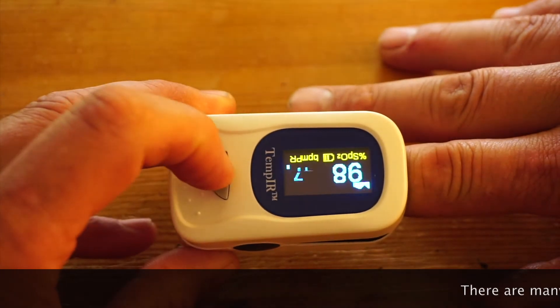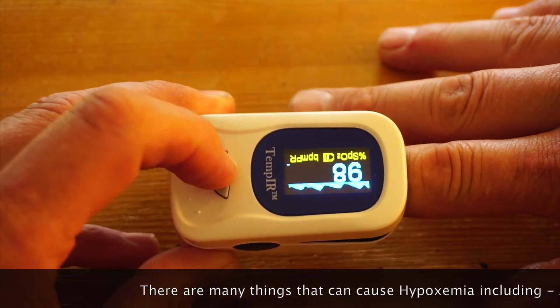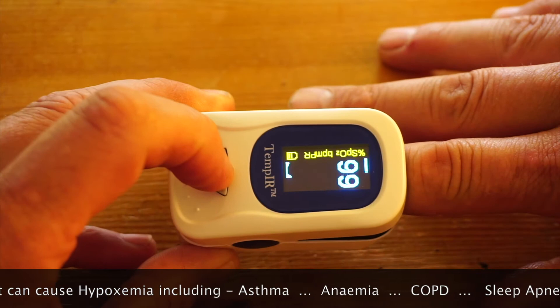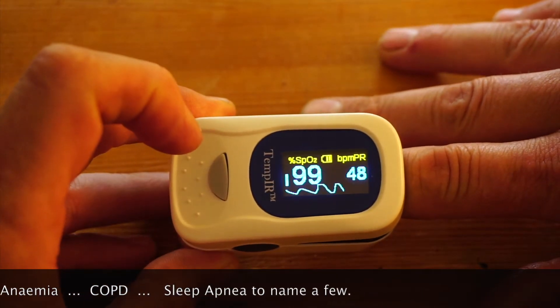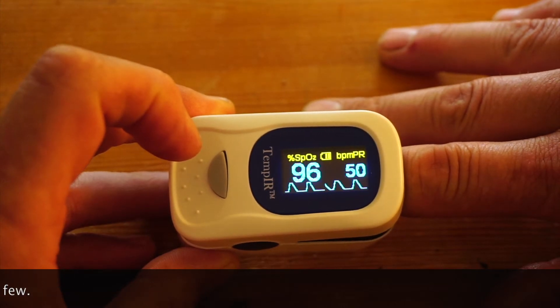The bleep is an alarm that I set on the pulse, alarming when the pulse rate goes below 50. Pressing the button during operation will rotate the screen into one of four different orientations, giving convenient access to the data from any angle.